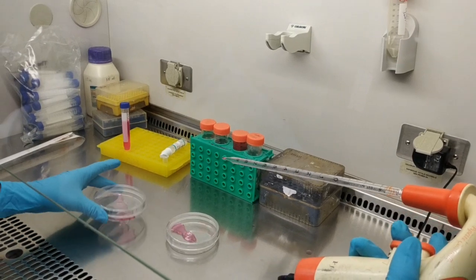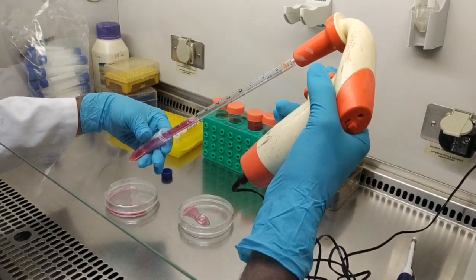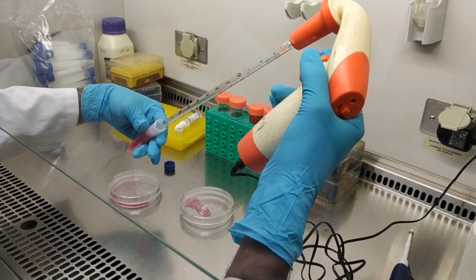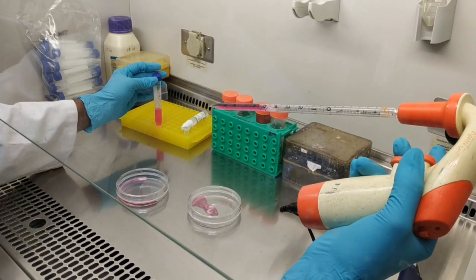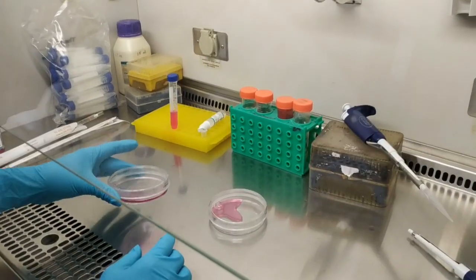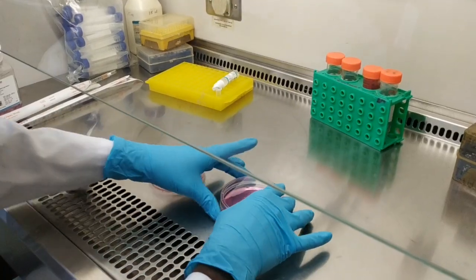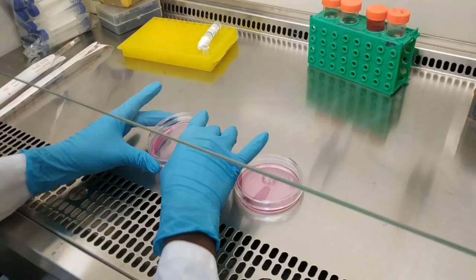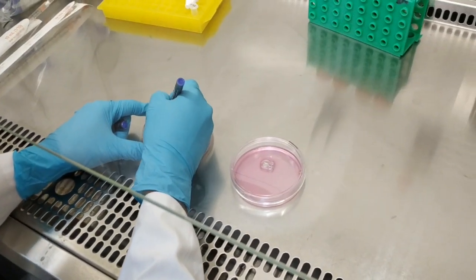After adding the medium, the resuspended cells can be added in this. These can be added, and then gently you can shake or tap it to distribute into the plate. Then make sure that there are no clumps or aggregations of the cells, as they might form aggregates if you do not disturb this, and then label it properly.